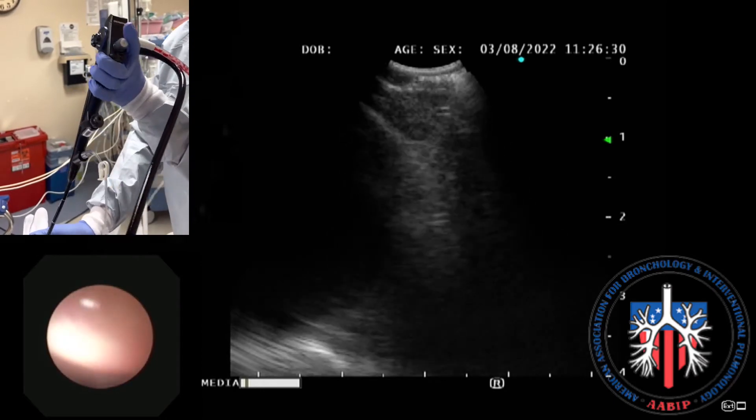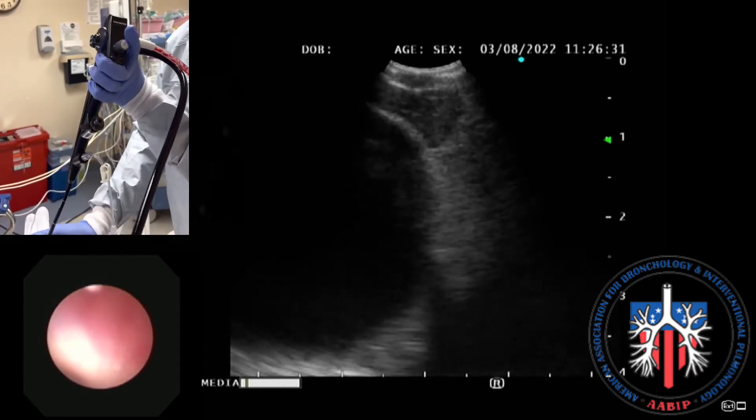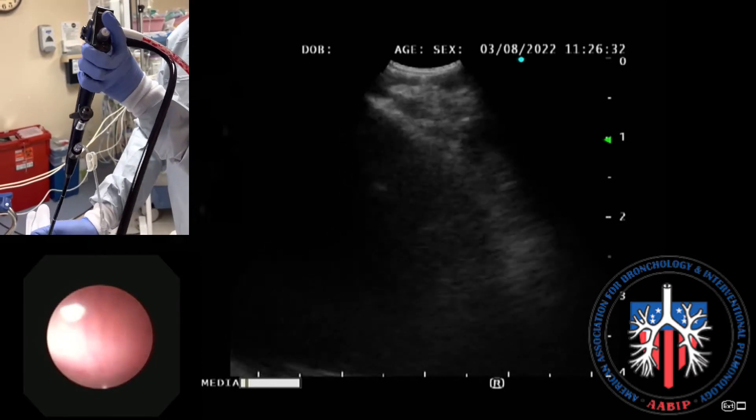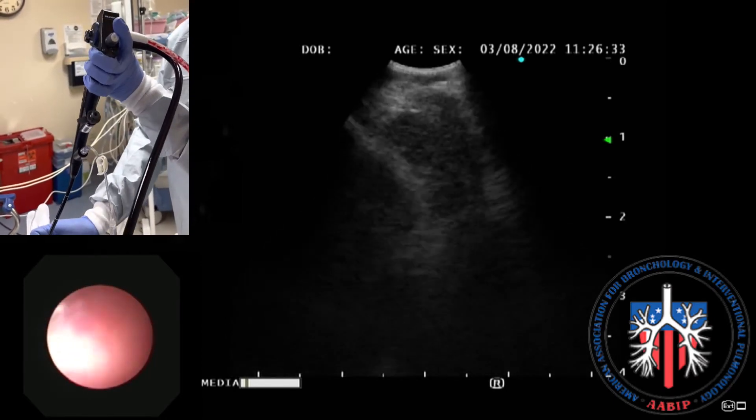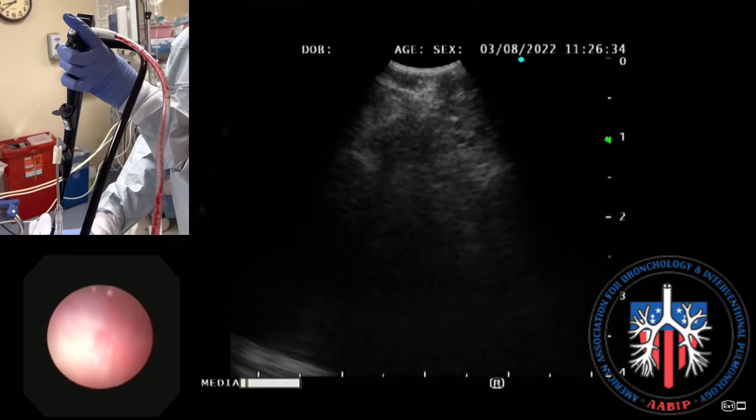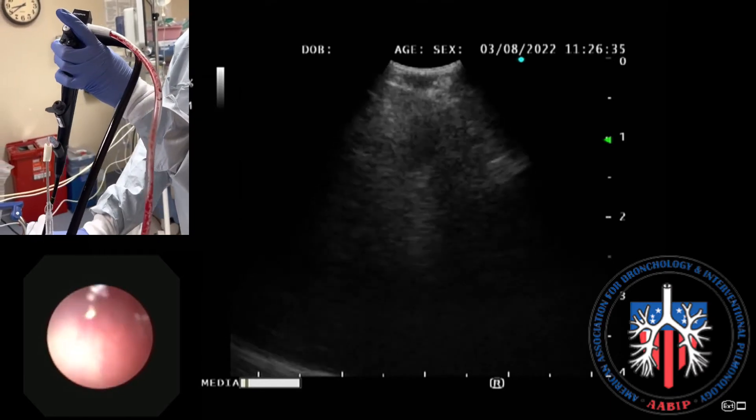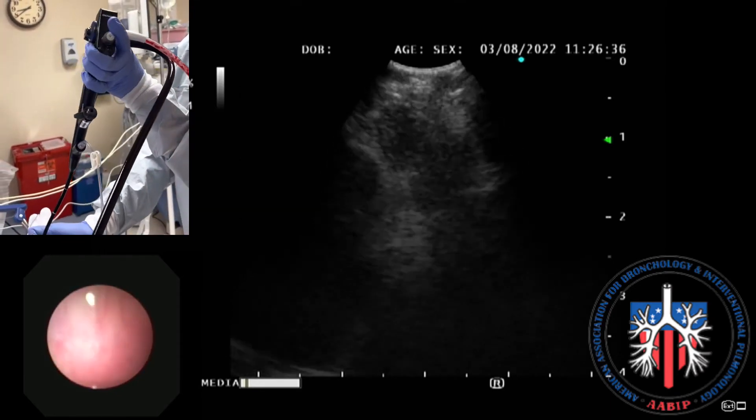The area between the pulmonary artery and aortic arch should be scanned by rotating the scope to identify any lymph nodes in the 4L location.